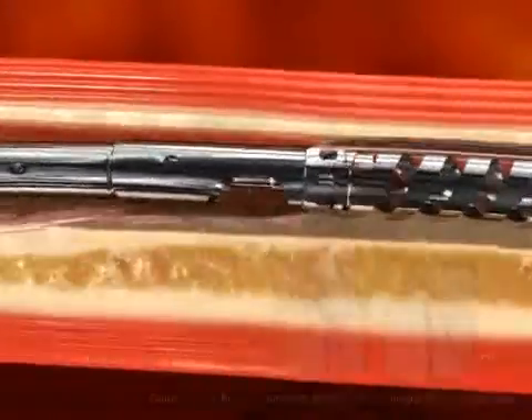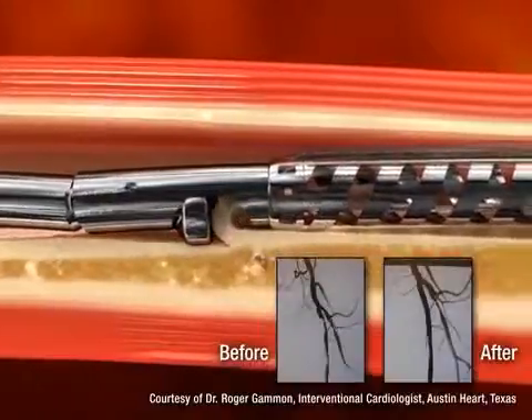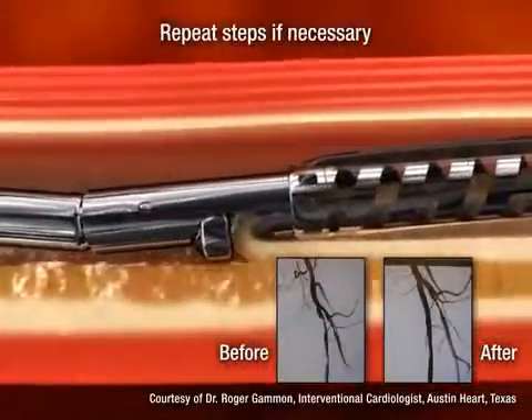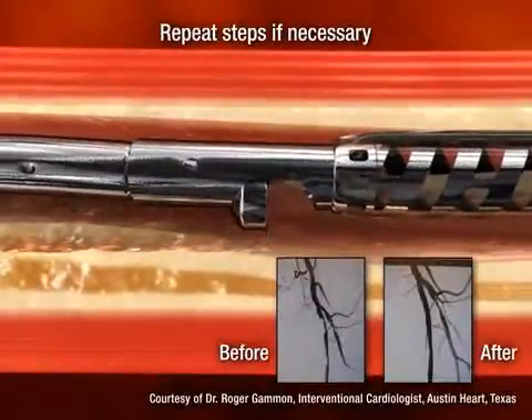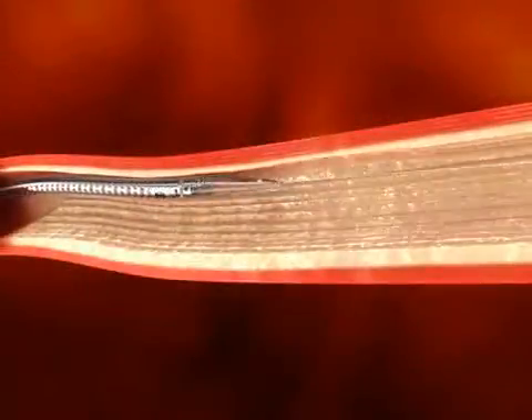Routinely view the artery using angiographic and/or intravascular ultrasound imaging to assess the extent of plaque excision.